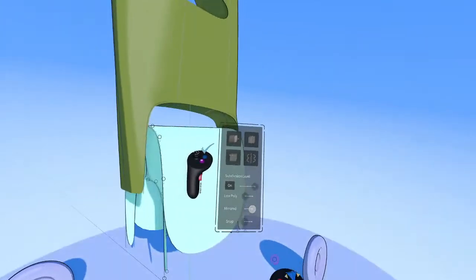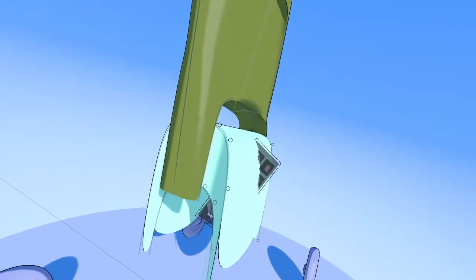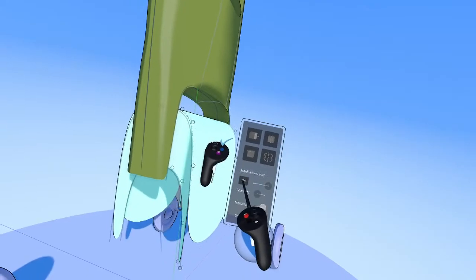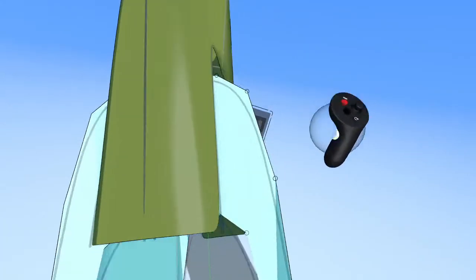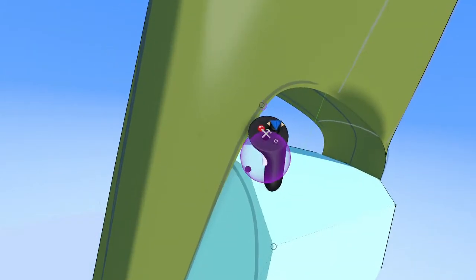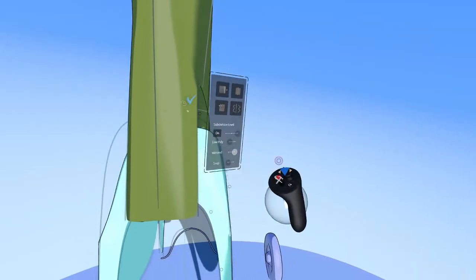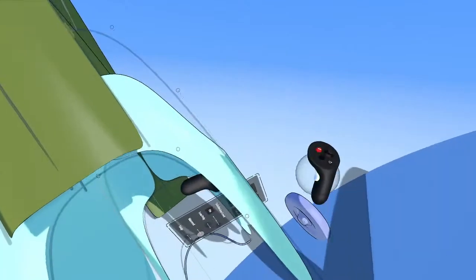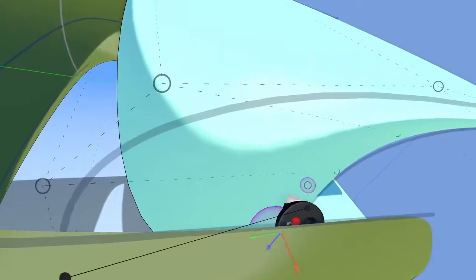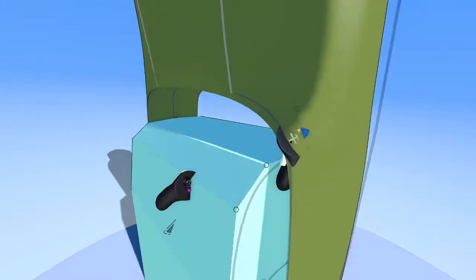Oh, so this is another useful thing that I probably should have been doing this whole time, but this is what your sub-D geometry looks like subdivided, obviously, and you can turn that off here with this on-off switch. Sometimes that's helpful so that you can understand exactly how this geometry is flowing. It was a little tricky for me to see where all those points were following through. And if I just turn off subdivision, it makes it a little easier.